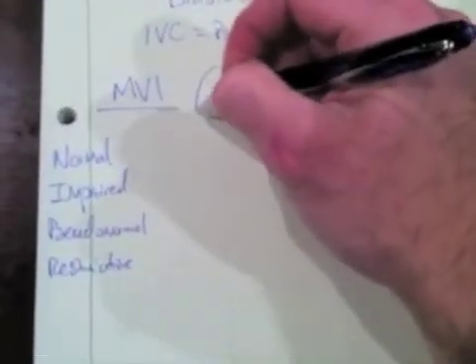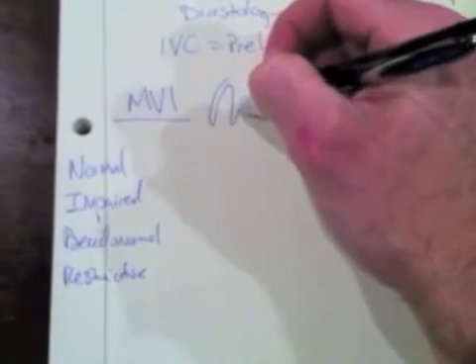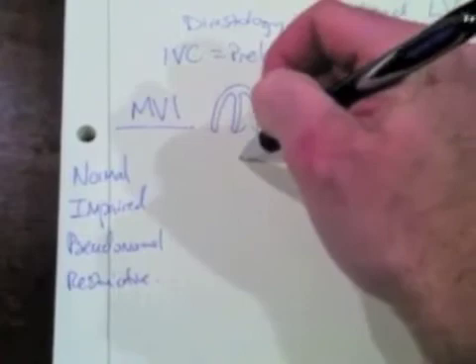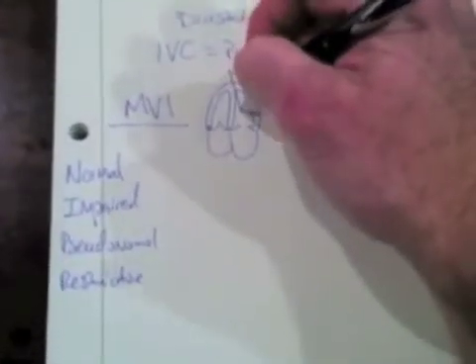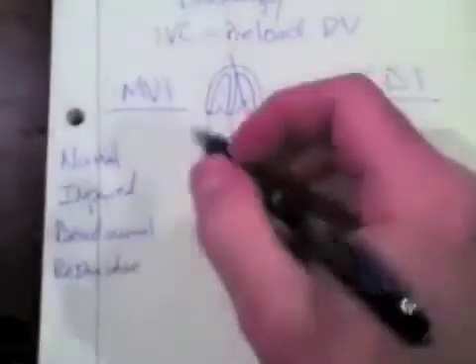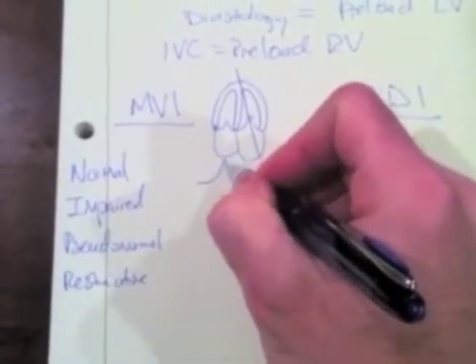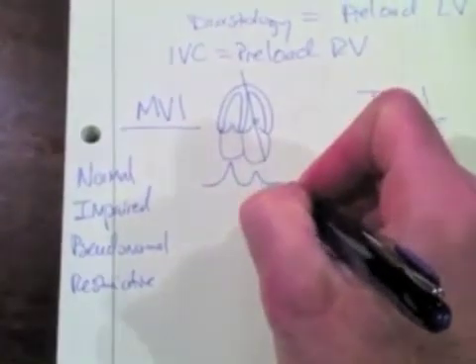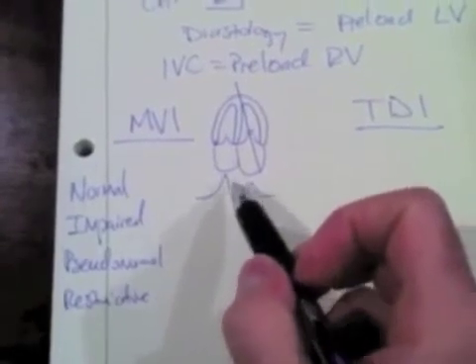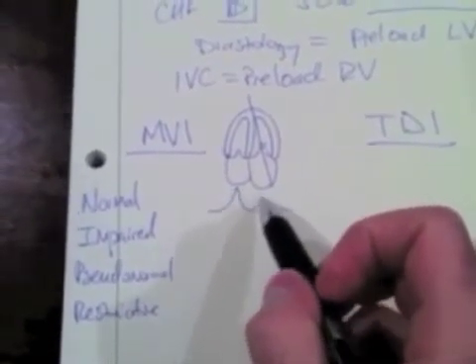So for the mitral valve inflow, what we're going to do is look at the apical 4-chamber view of the heart, and when we do that, we get an image that looks something like this. What I'm going to do is use pulse wave Doppler, and I'm going to put the gate of my pulse wave signal right at the tips of the mitral valve leaflets. Okay? And what I get in a normal person is an E wave and an A wave. Okay? And that's the velocity of blood cells that go into the left ventricle during early filling and the atrial kick.